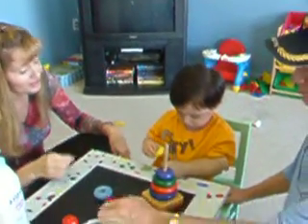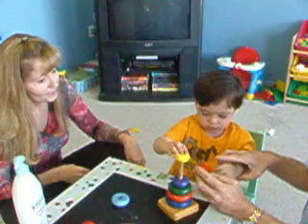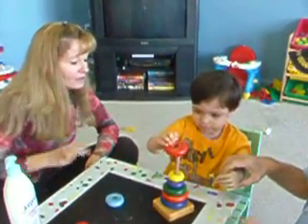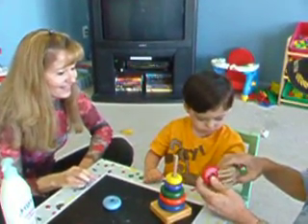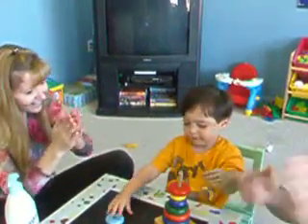Do this one. Let mom see. Do this one. Okay. Do this one. Okay. Ready? You want to do it? Open. No, no. Let's do it with this hand. Let's do this hand. Open. Open. Okay. There you go. Put it on.